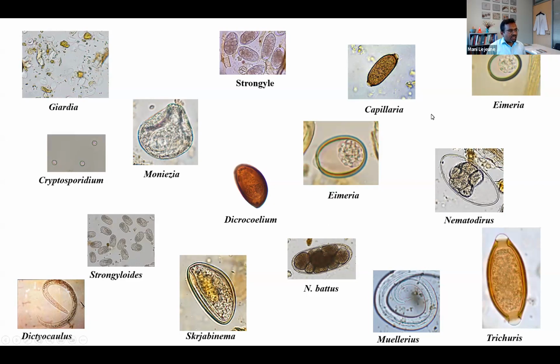And I do have here Coccidia, otherwise called Eimeria, the stages of which would look similar to what I present here. And Strongyles represent a group of roundworms, which are mostly present in the gastrointestinal tract, abomasum, as well as the small intestine. And they shed a parasitic stage, which is the eggs. The eggs look the same for most of these roundworms, and we call this group Strongyle. And here, Moniezia, which is a tapeworm that is voided again in the feces.